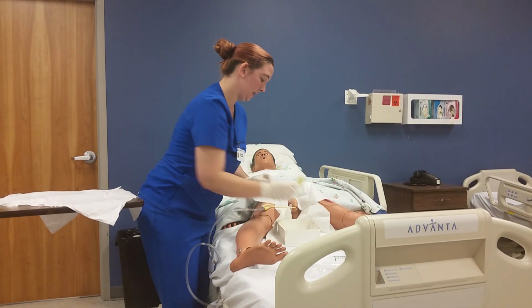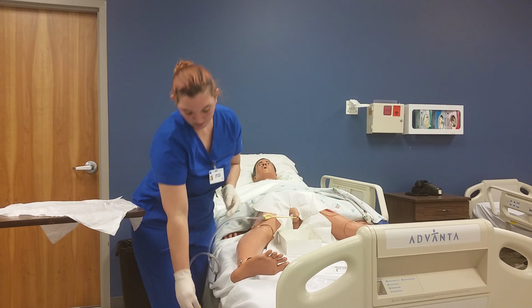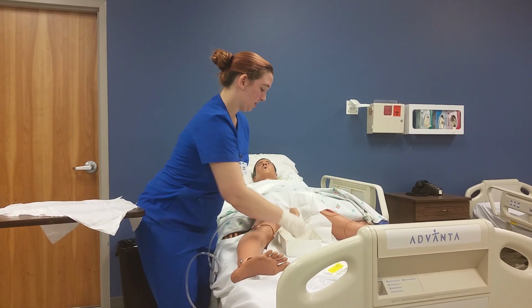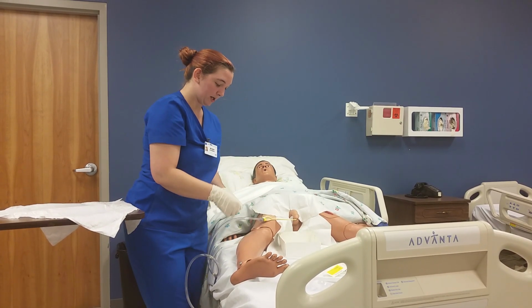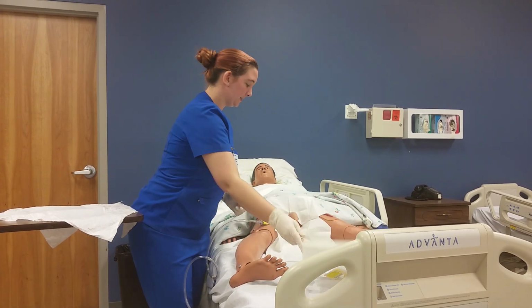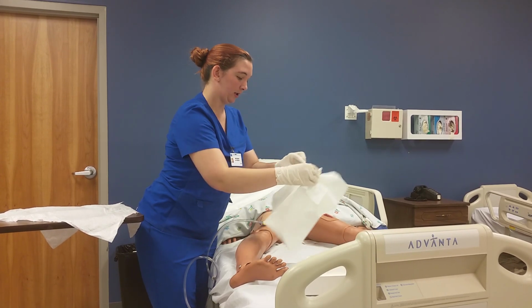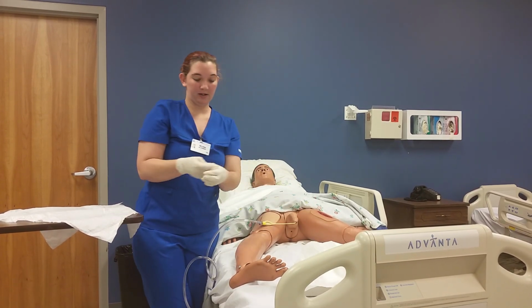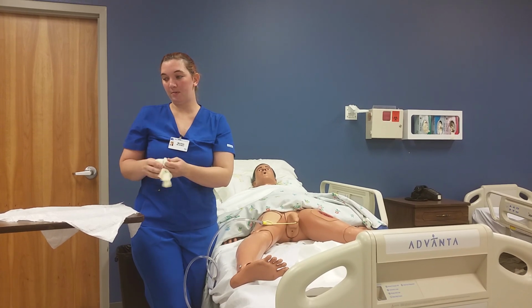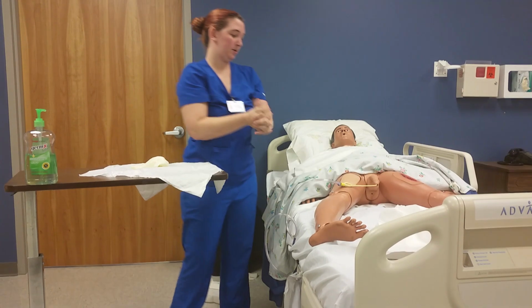I'm going to take my strips here, sign my name, sign the date. I'm going to put one here. I'm going to sign my name, sign my date, and I might put it around the top here. I'm going to get rid of this. We're done with all of this. So we're going to get rid of it. I'm done with my gloves. I'm going to take them off, get rid of them, wash my hands.